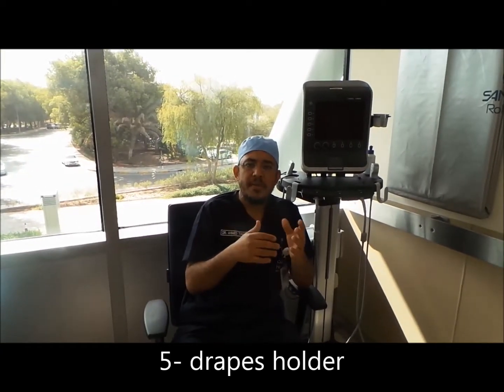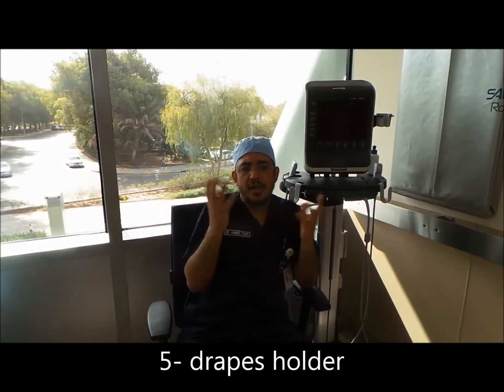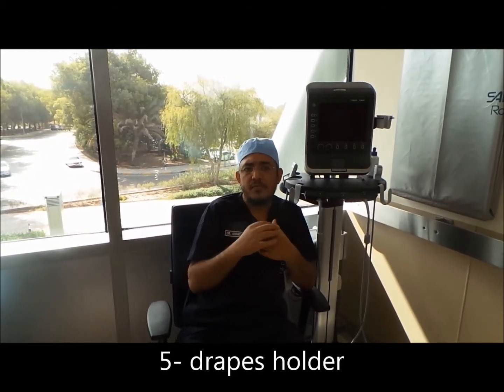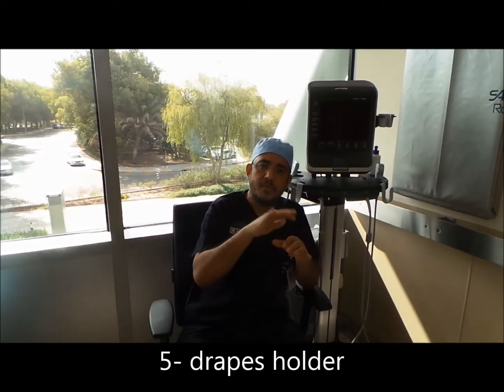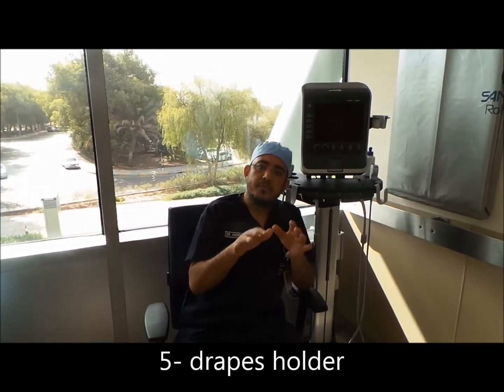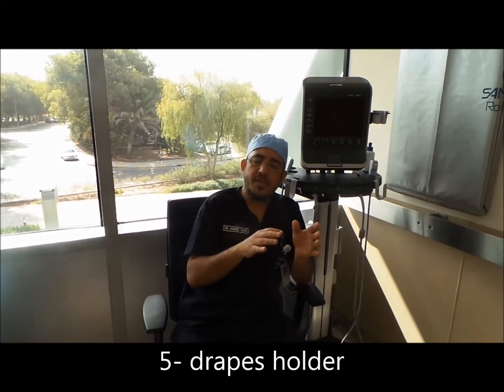Another important point is claustrophobia. Many patients, when draped, don't like the drape coming on their face — it makes them feel uncomfortable. You can prevent this by putting the drape on a holder, so there is no direct contact between the drape and the patient's face.